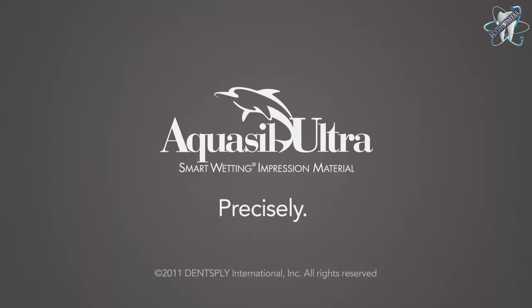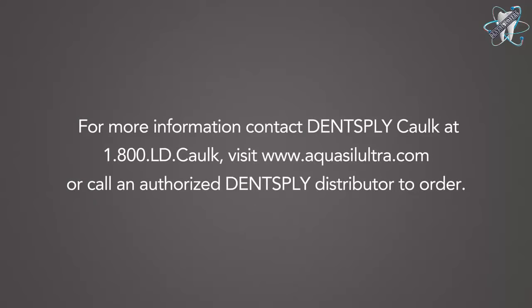Another successful single unit procedure was made possible by using the unique combination of products found in the AquaSil Ultra Single Unit Procedure Kit. For more information, contact Dentsply Caulk at 1-800-LD-CAULK, visit www.aquasilultra.com, or call an authorized Dentsply distributor to order.